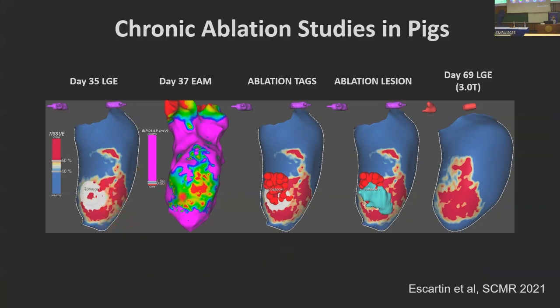It corresponds to the electroanatomical map where we can similarly see those intermediate intensities. So we're going to target that area. This is all done in a conventional cath lab right now. We basically use a CARTO system. We do a bunch of ablations to try and homogenize that heterogeneous scar. And then we take the animal to the MR.